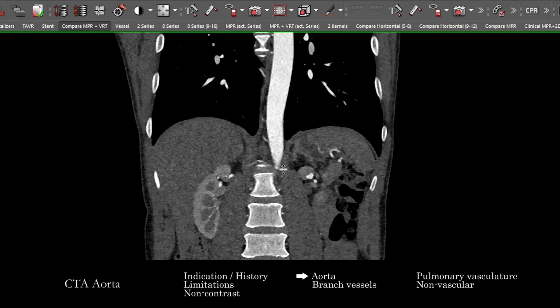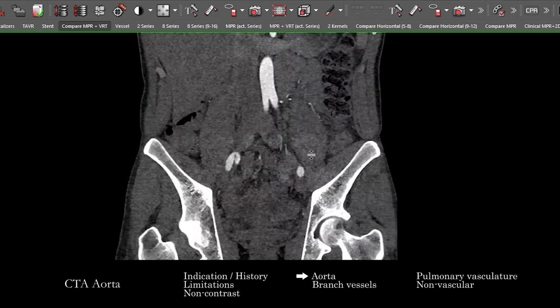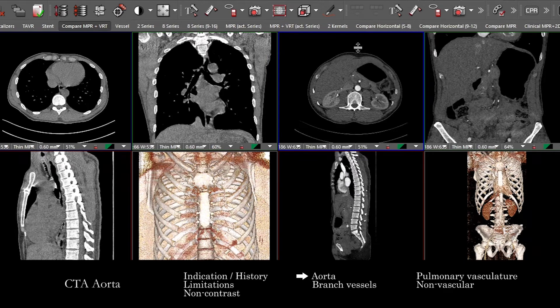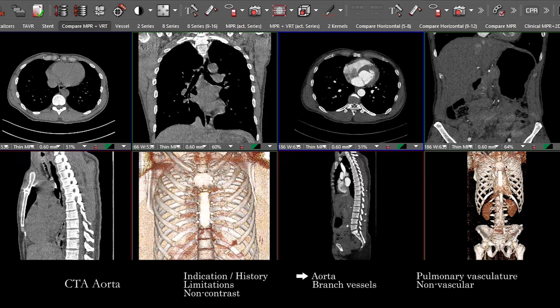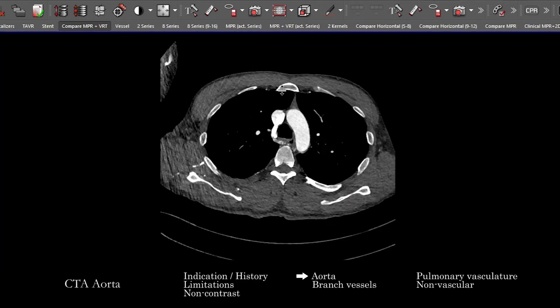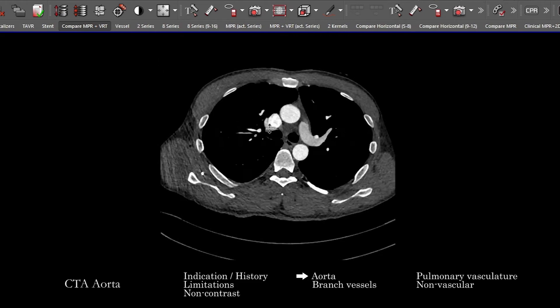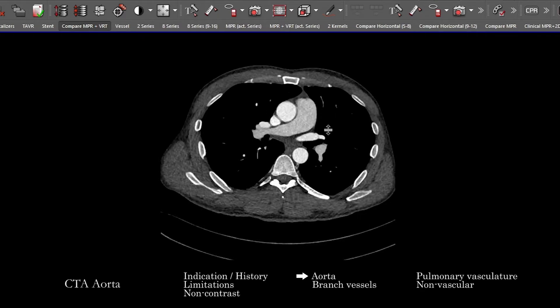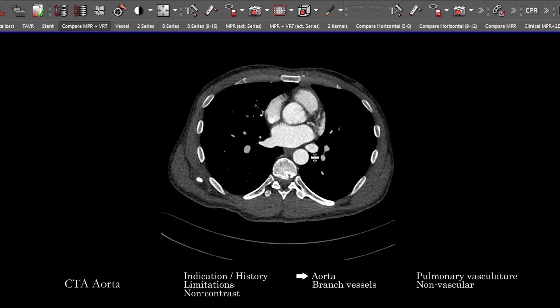Going through the whole aorta, look for linear filling defects suggesting dissection, and contour abnormality suggesting pseudoaneurysm. I like to use a combination of axial and coronal images, zooming as needed, following from the root through the entire course of the aorta through the chest, abdomen, and pelvis. Also look for wall thickening, abnormal wall enhancement, or soft tissue stranding surrounding the aorta, which may suggest vasculitis or other vasculopathy.